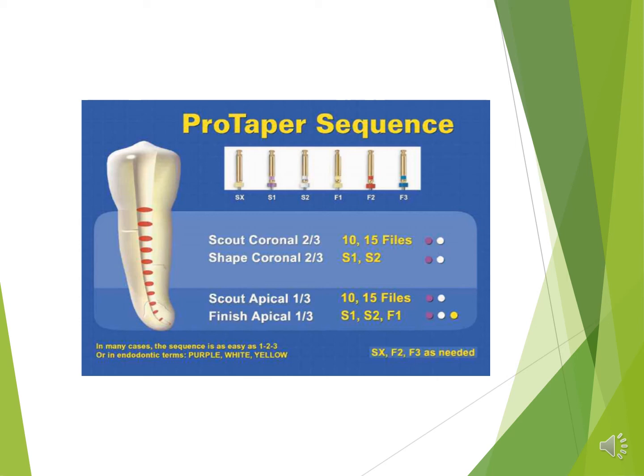In the presence of sodium hypochlorite, gently float the S1 into the canal and passively follow the glide path. Before you encounter light resistance, laterally brush and cut the dentine on the outstroke to improve straight line access and apical progression. Always remember to brush away from the furcation. Continue shaping with S1 until the depth of the 15 hand file size is reached. Use S2 exactly as what we have used for S1 until the depth of 15 hand file is reached.